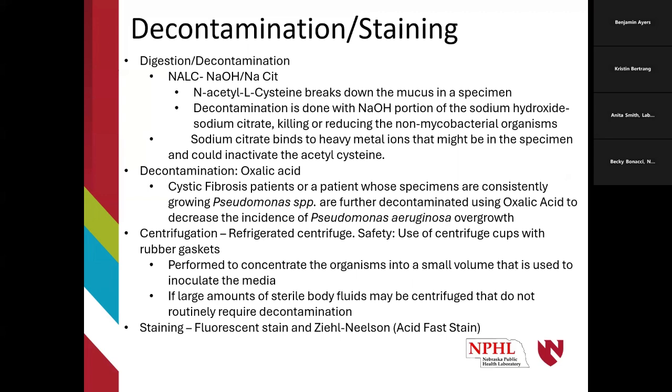It goes on simultaneously. The digestive part is the N-acetyl-L-cysteine, which breaks down the disulfide bonds in the mucus, so it liquefies it. Then the decontamination part is happening with the sodium hydroxide, so this helps by killing or reducing non-mycobacterial organisms.